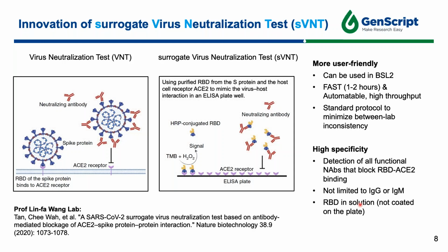And the RBD in the SVNT is in solution instead of coated on the plate. So this allows the RBD to be in a more native conformation that more closely resembles the in vivo condition.